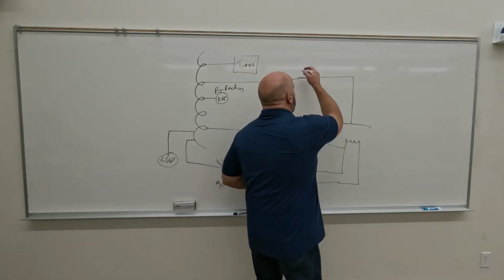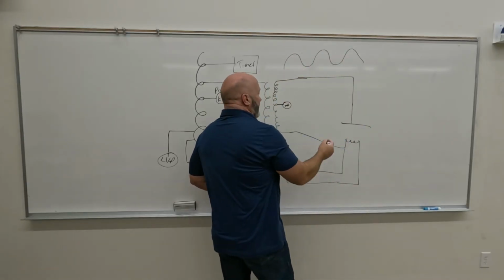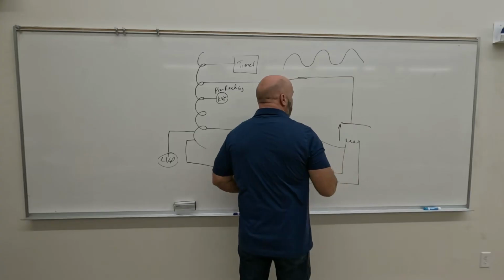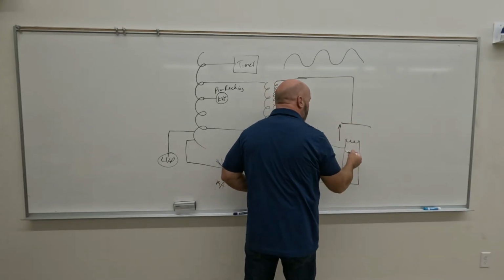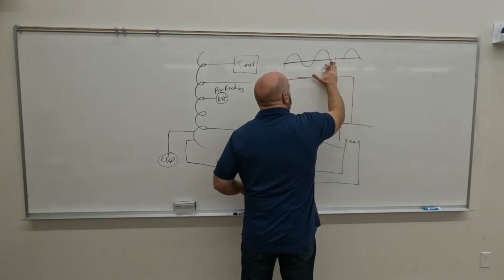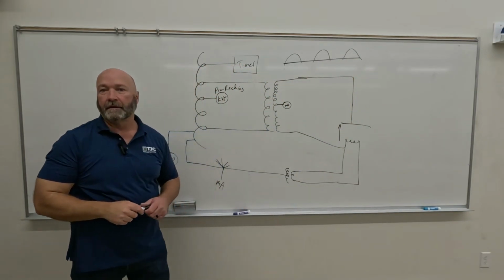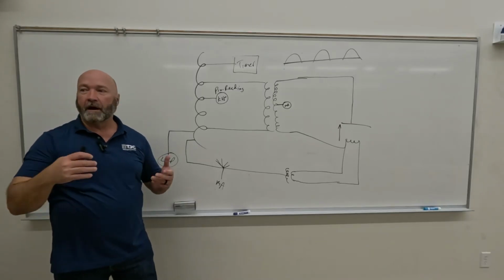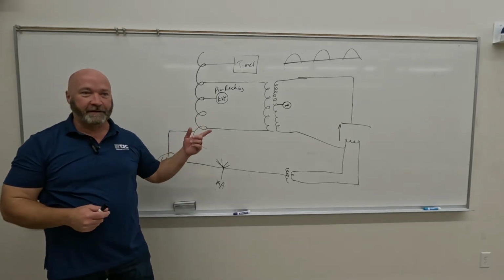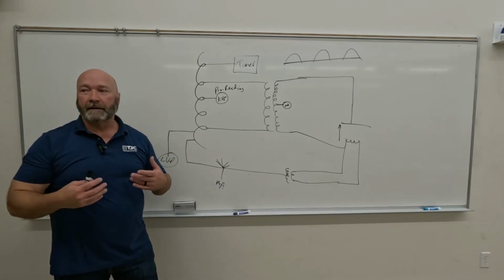So we've got a voltage waveform that does this, right? If electrons go that way, but they can't come back that way, then what we do is take our voltage waveform and cut it in half, and we're only using half of it. So now I've gone from inefficient to half of inefficient, right? So we don't want to do that. We want to make it more efficient.